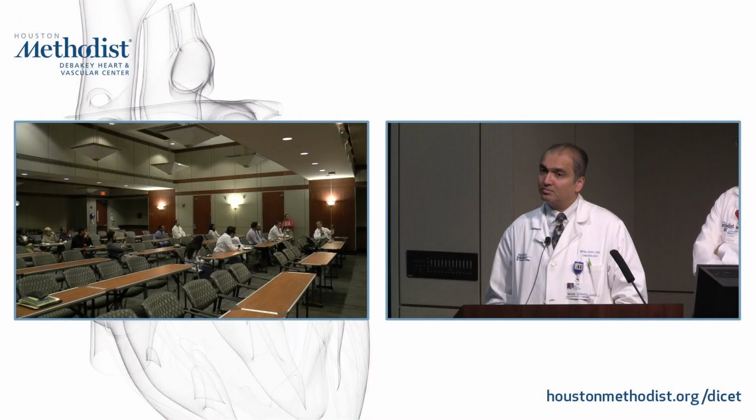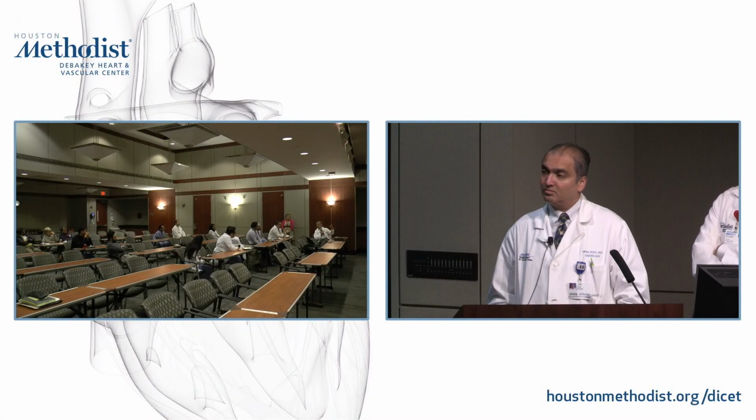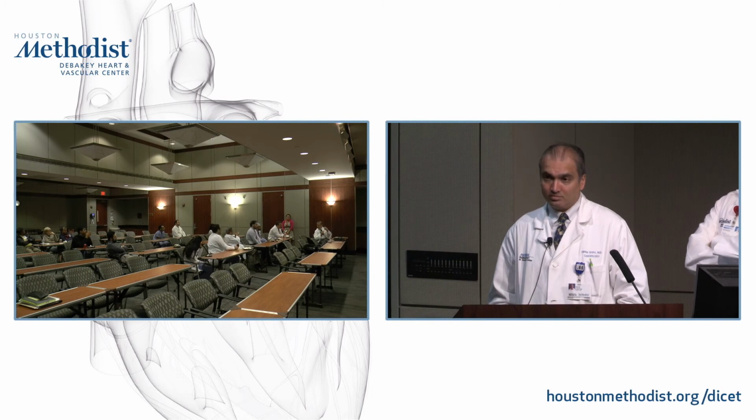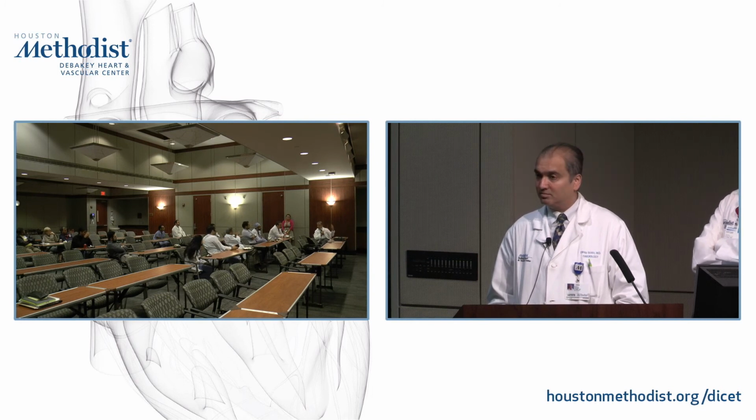regurgitation. The percentage becomes important when your total stroke volume becomes less, in a depressed ventricle, in a low output state. This is where you start thinking about how much of that total ejection of the heart is regurgitating one way or another. Unfortunately, once you get to lower numbers, the error in regurgitant fraction becomes higher. Why? Because you're dealing with small numbers, so the difference divided by the large number becomes high. So your crux is regurgitant volume. Regurgitant fraction is to modulate that, particularly in the lower flow state.